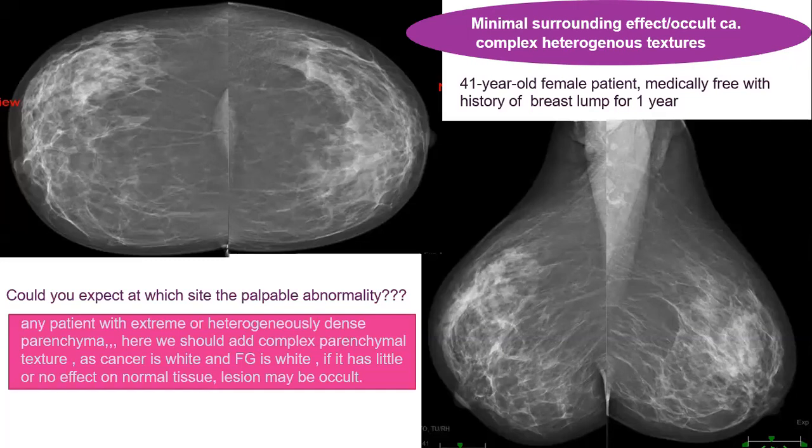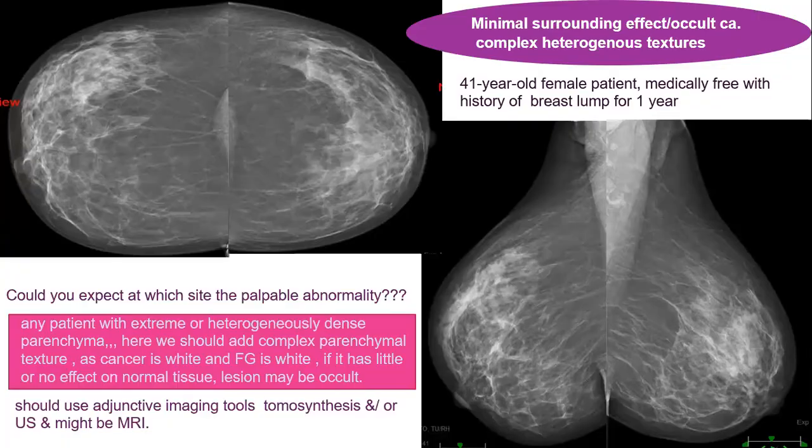Nowadays, before that, tomosynthesis. Yes, tomosynthesis. We should use adjunctive imaging tools like tomosynthesis and ultrasound, and probably later we can proceed to MRI.